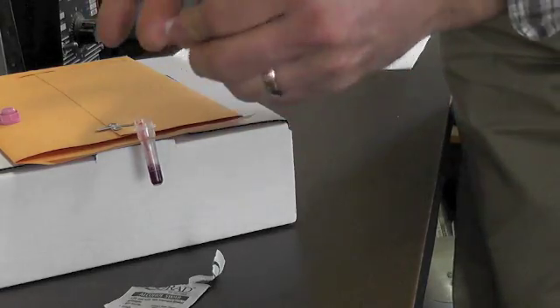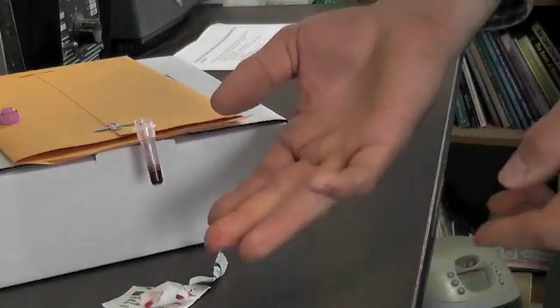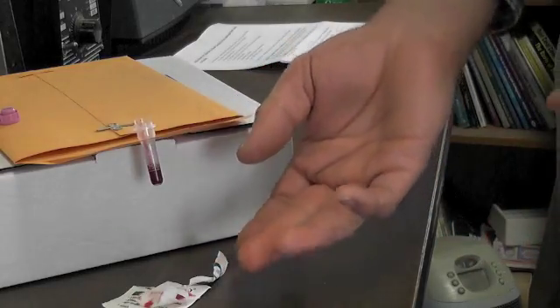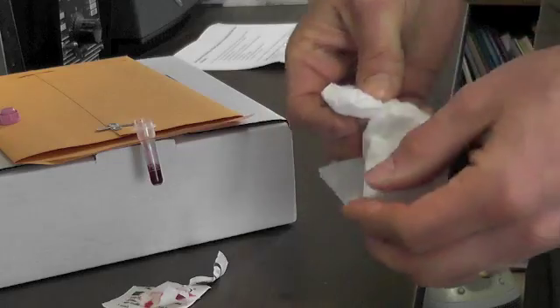You can wipe off your finger there. You may want to take a tissue to wipe off your finger and make sure it doesn't keep on bleeding. Sometimes people have trouble bleeding afterwards much more than before. You can take a tissue and just hold it on there, put some direct pressure on there for a few minutes so that stays okay.